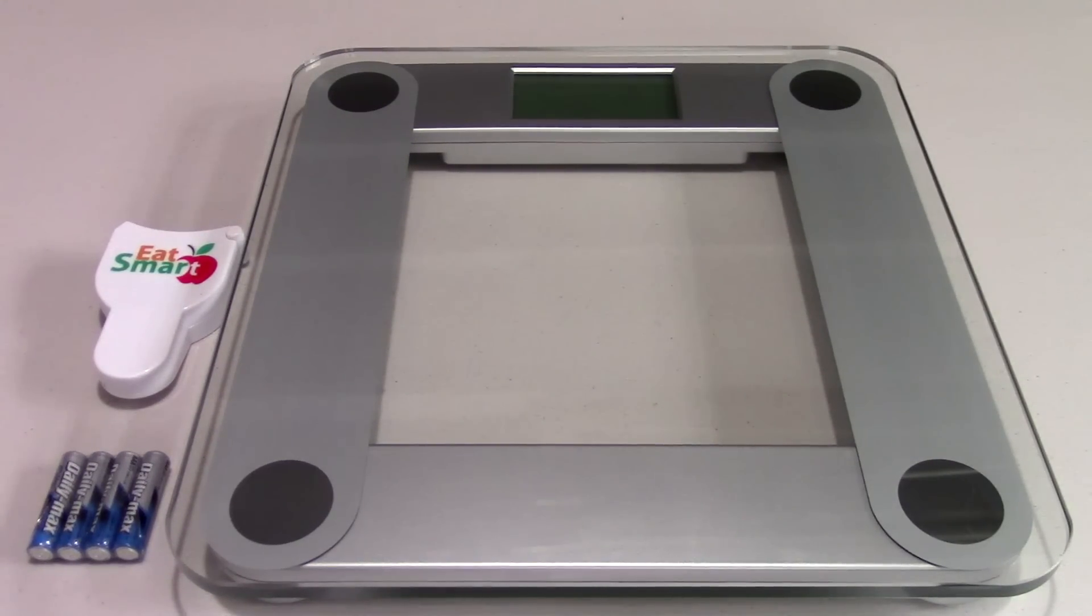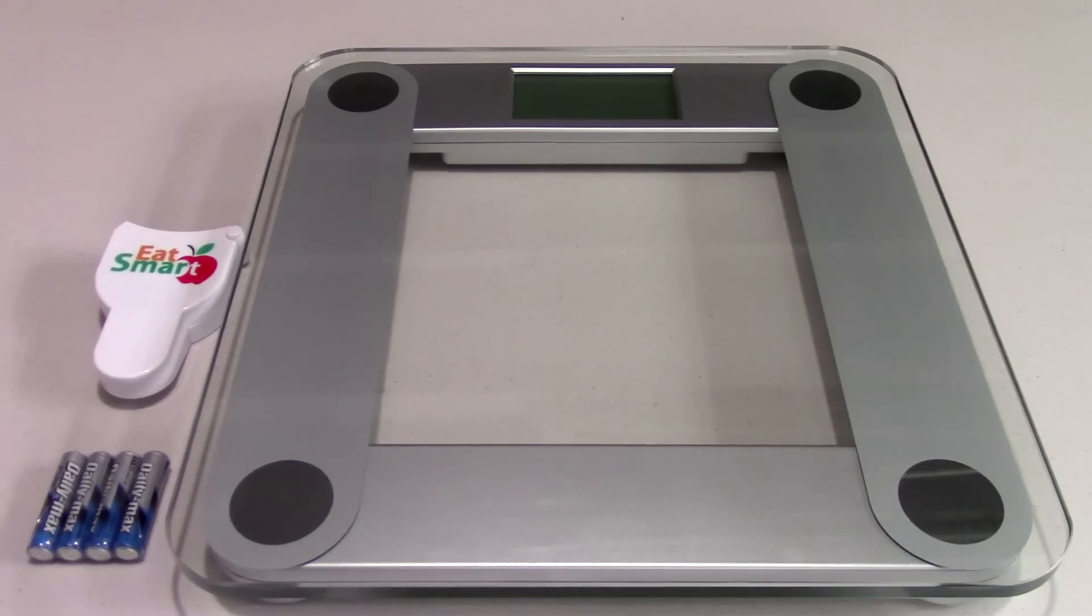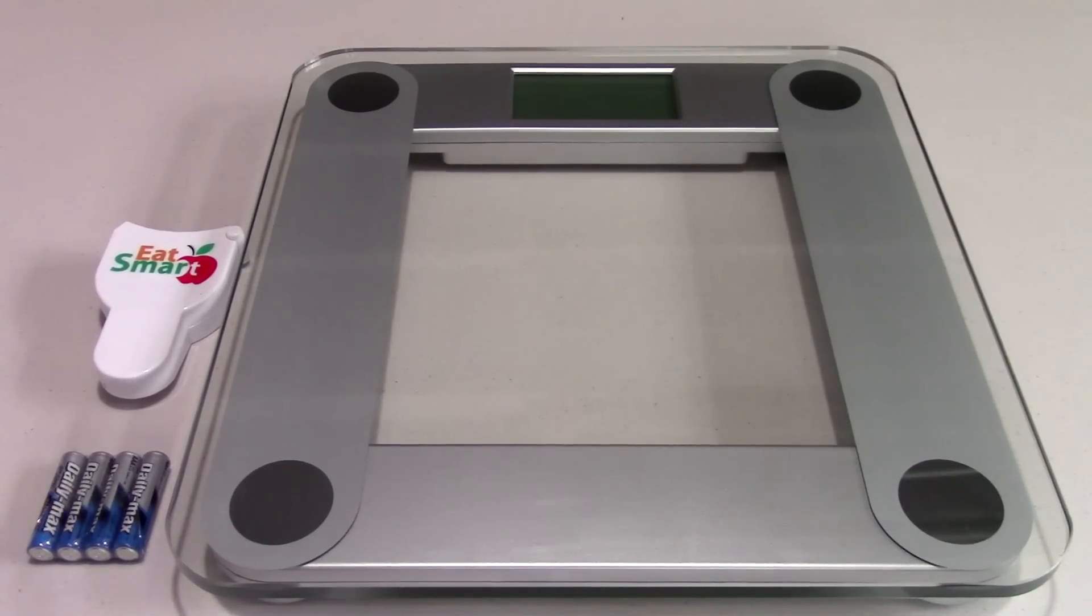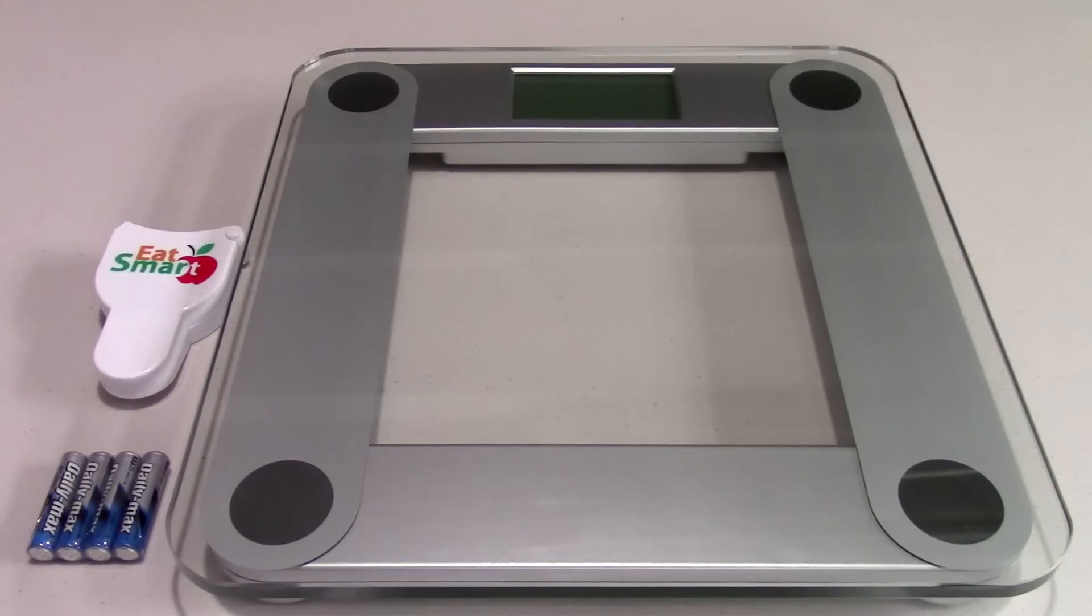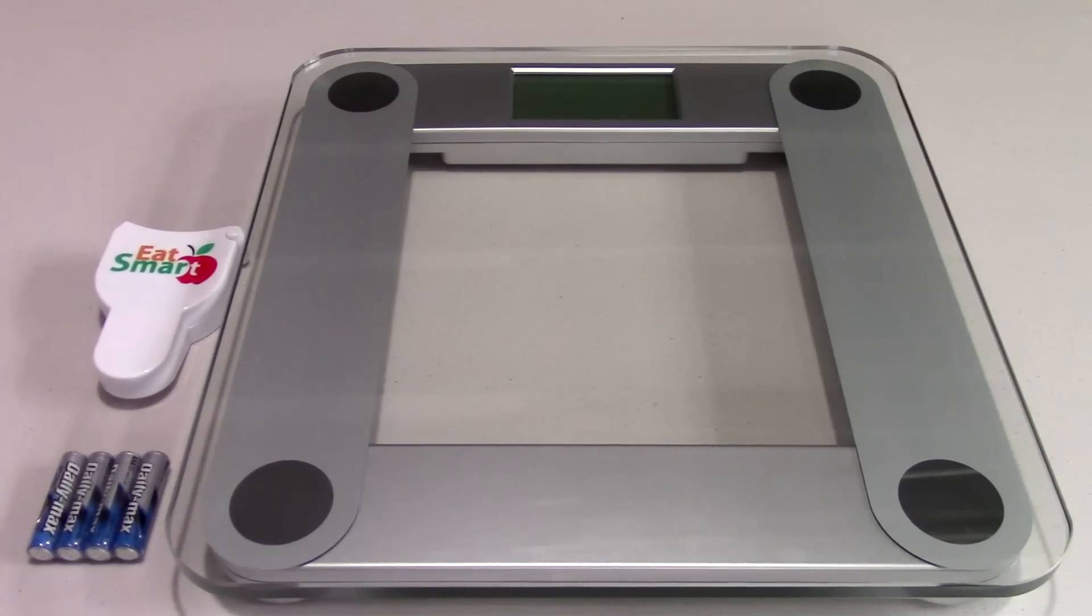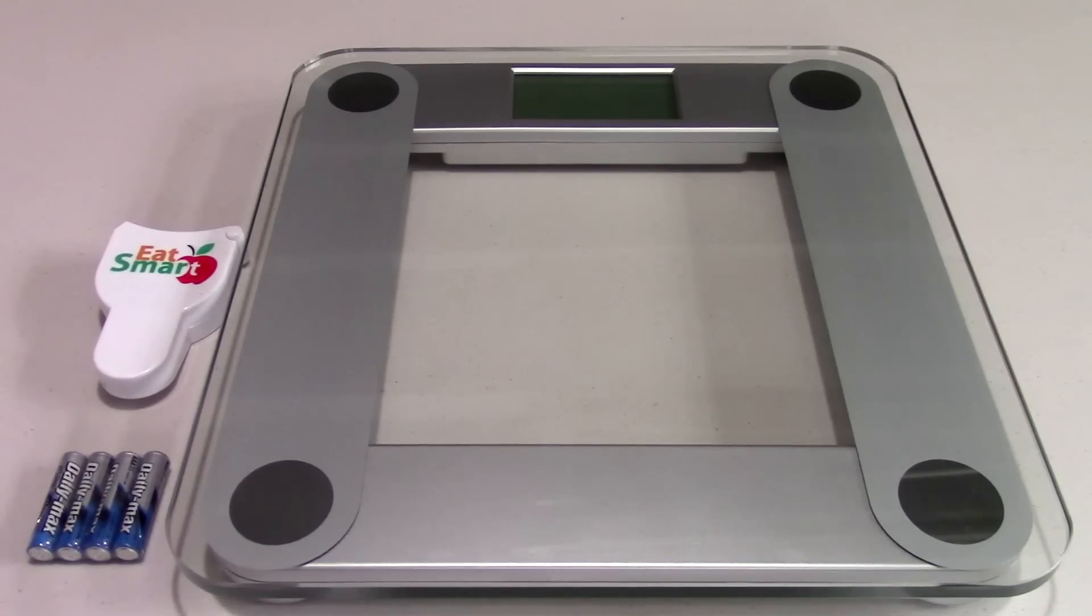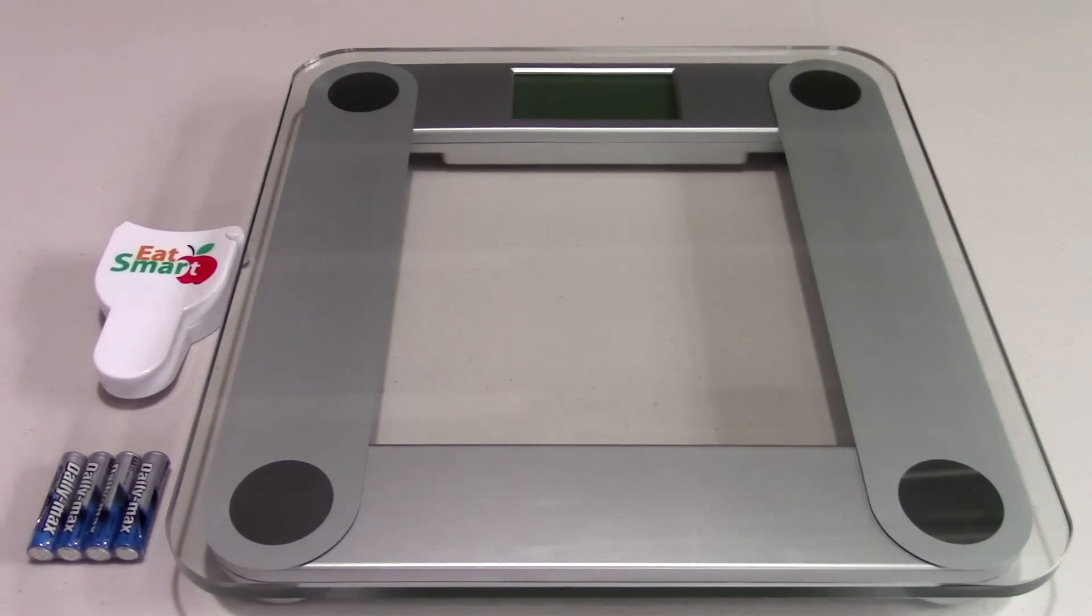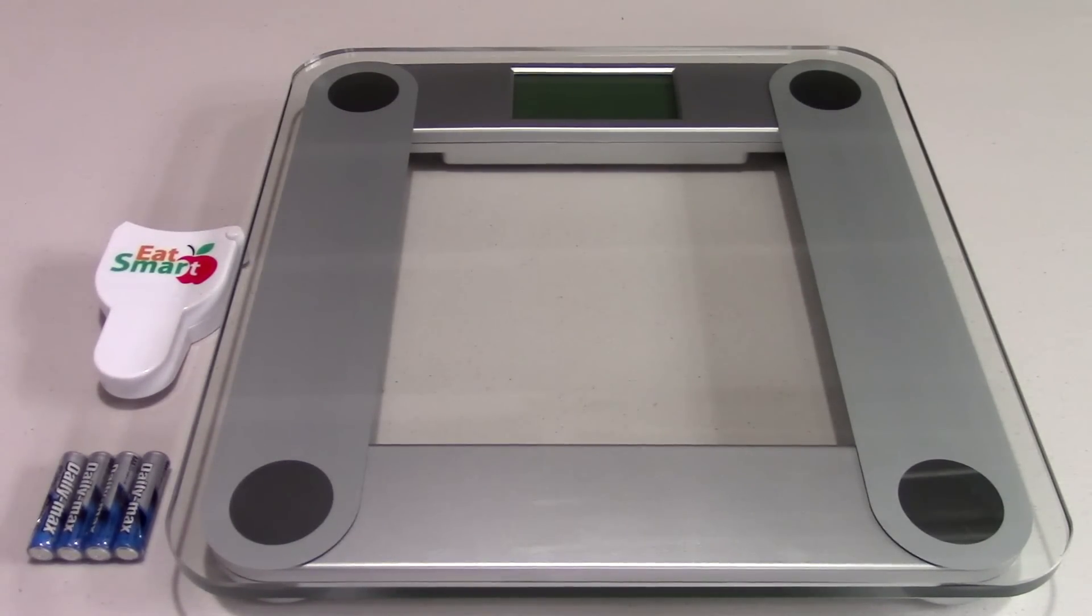This is just a basic scale. Its main features are simply weighing you, whereas other scales have bone density percentages and body fat percentages and all that fun stuff. This gets right down to the basics, which I think makes it extremely good. There's less stuff to go wrong on it.